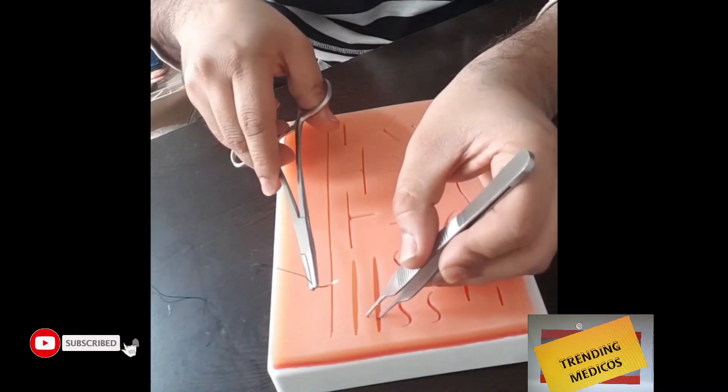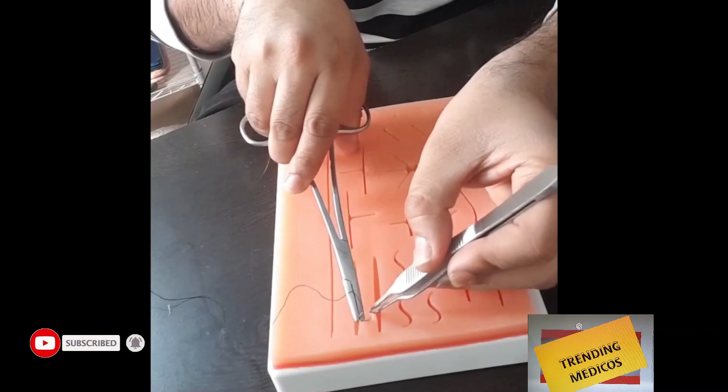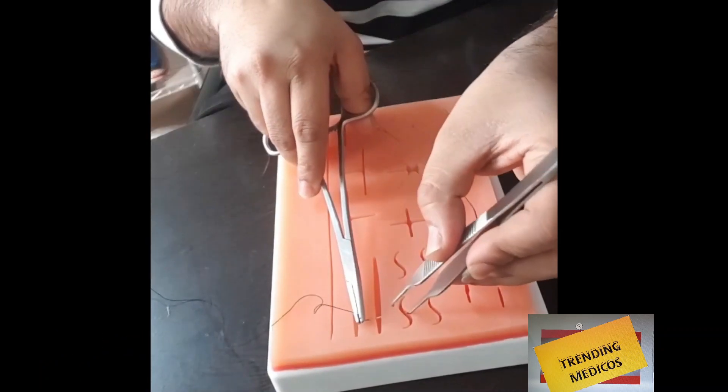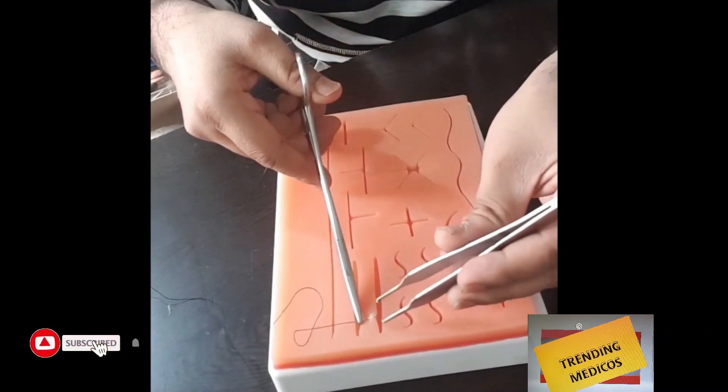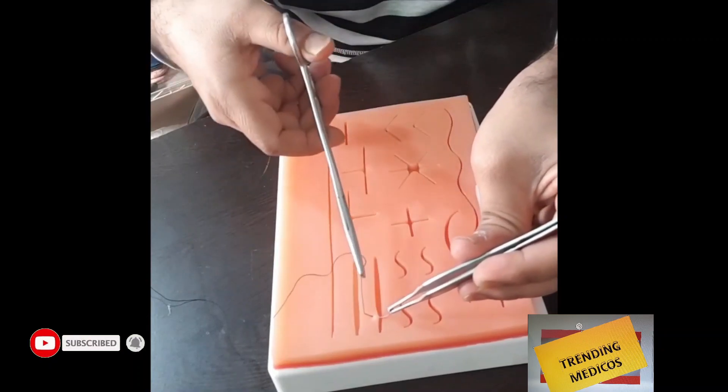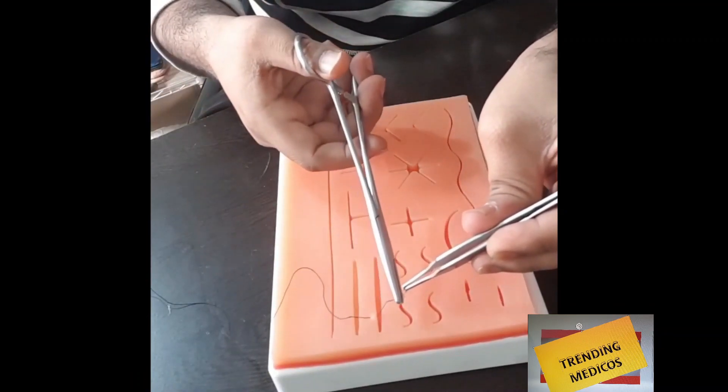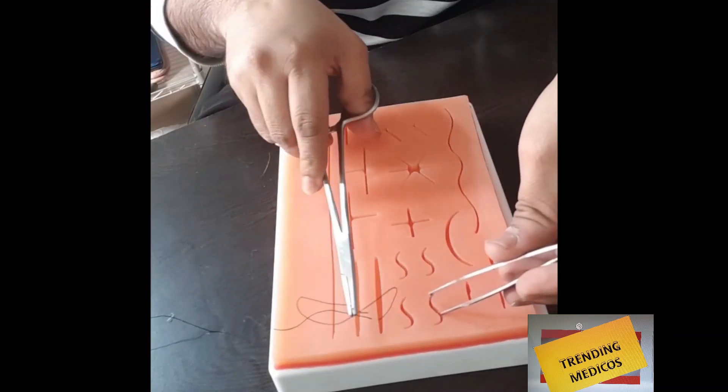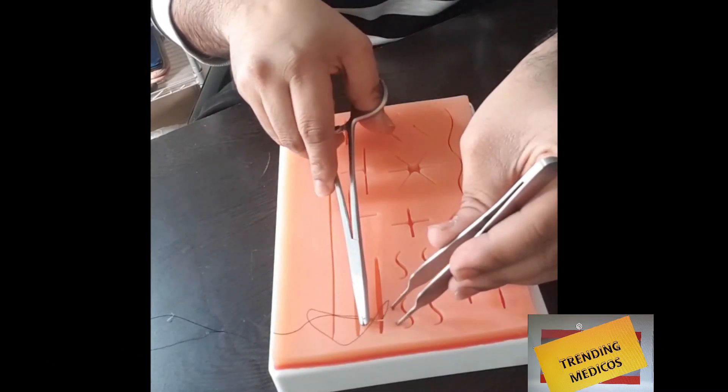What we need is a forcep, a needle holder, and scissors. You have to go perpendicular to the incision, and your movement should be at the wrist joint. Initially when you're learning, you should go one by one - one edge should be inserted first, then the other edge.